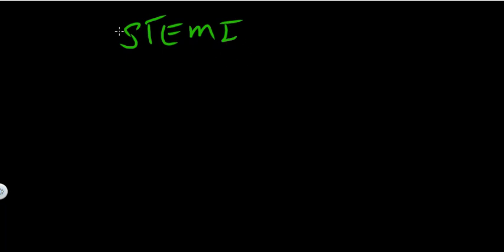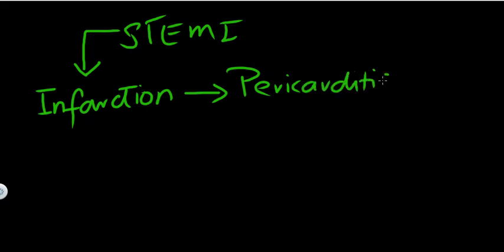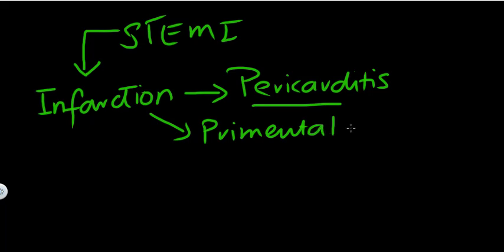So what can be the causes? On top of your head, you should rule out infarction, and it can be seen mostly in pericarditis and Prinzmetal angina.